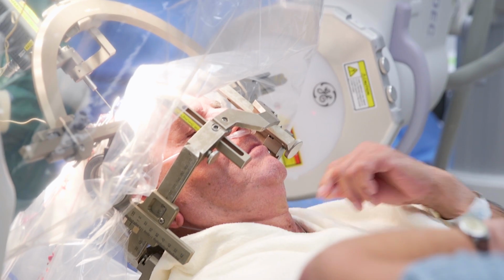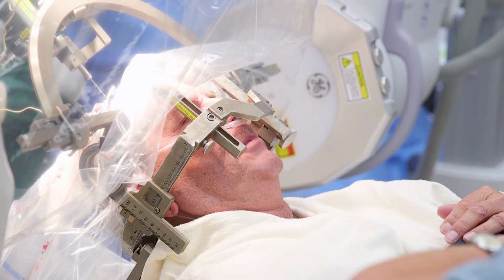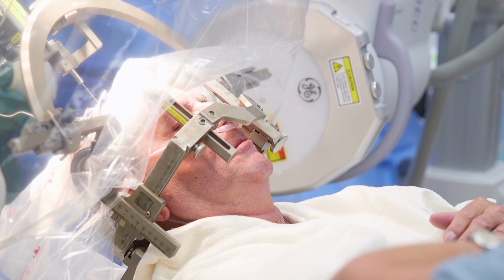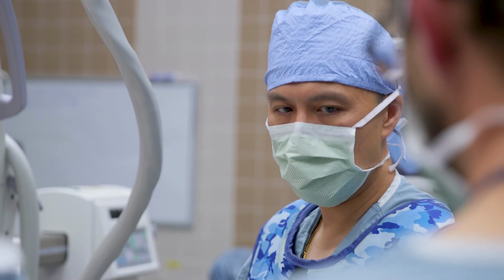As fast as you can. Go. Huckleberry, huckleberry, huckleberry. Perfect. You can stop. So you did 7 huckleberries in 5 seconds.